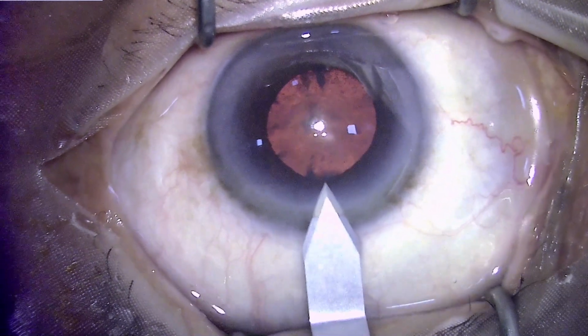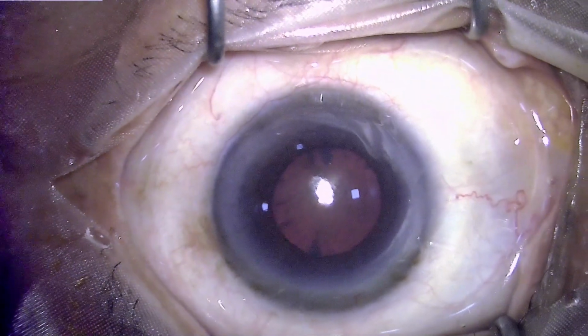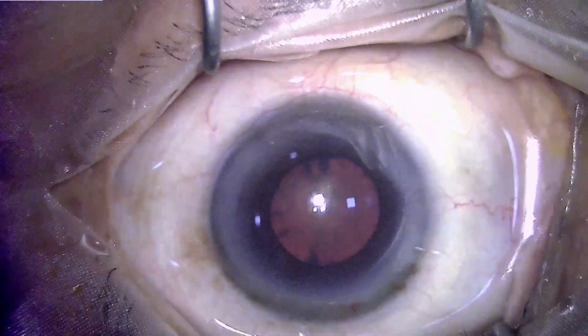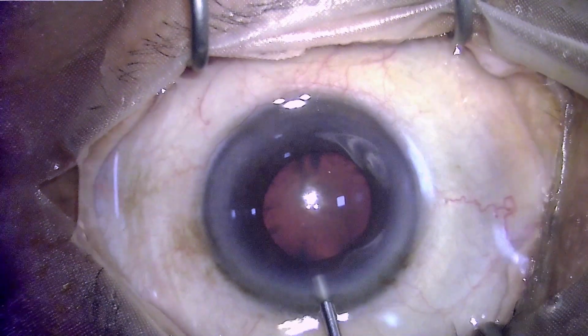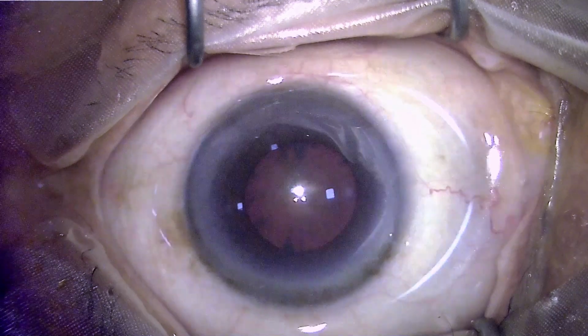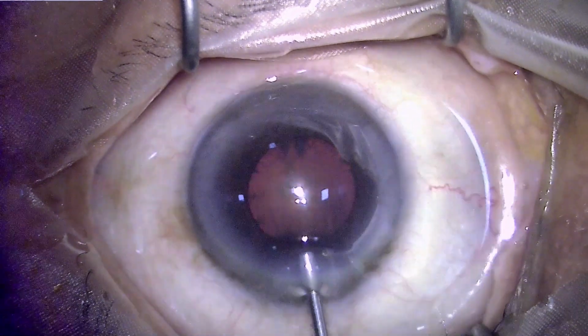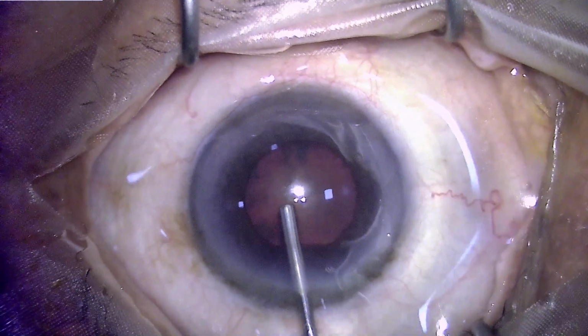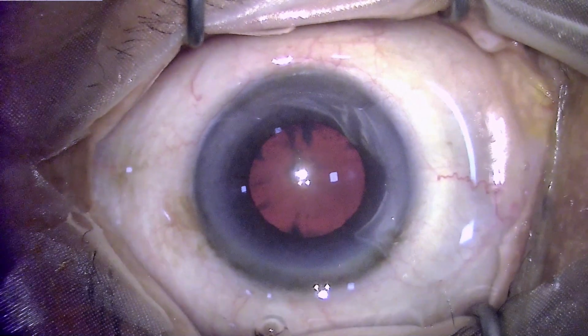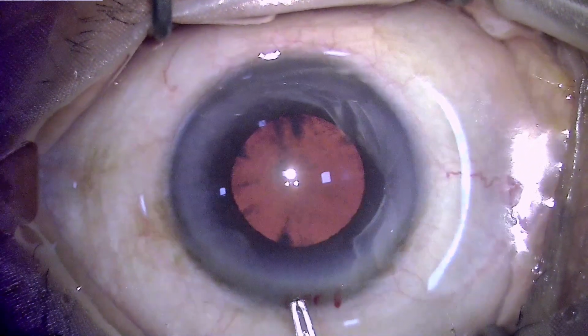This is important because it is not desirable that these patients should have any astigmatism. And clear corneal incisions, because they are very close to the center of the cornea, induce some surgeon-induced astigmatism, which can be used as a tool to modify pre-existing astigmatism. Then a rhexis which has to be sized properly so as to retain the IOL in the center.